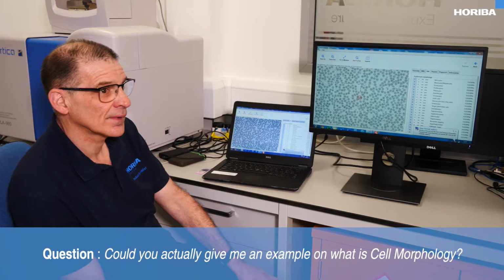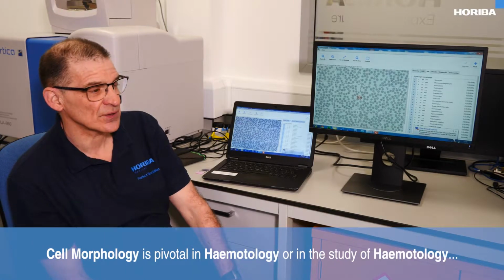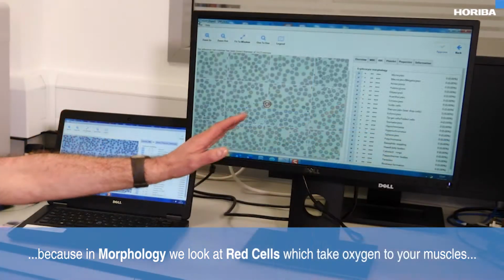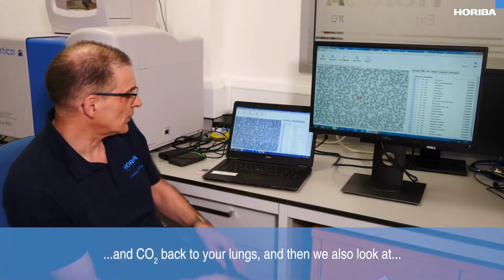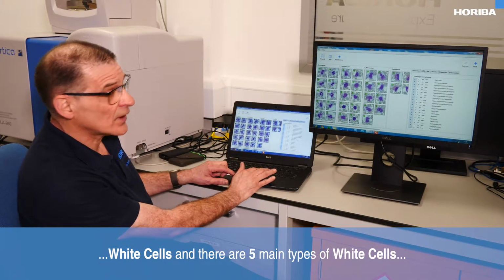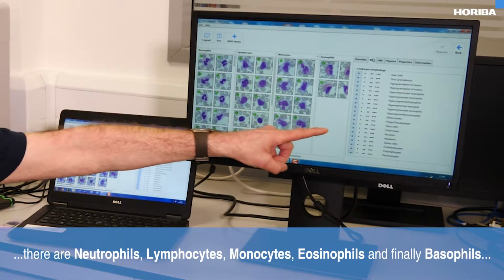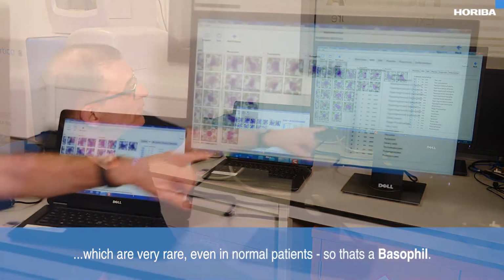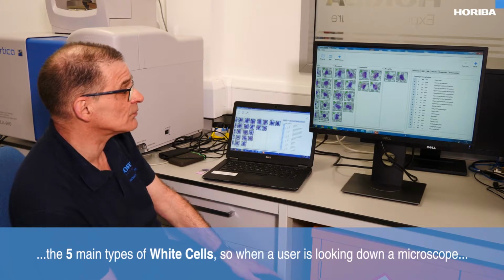Andrew, could you actually give me an example of what is cell morphology? Cell morphology is pivotal in haematology, or the study of haematology, because in morphology we look at red cells which take oxygen to your muscles and CO2 back to your lungs, and then we also look at white cells, and there are 5 main types of white cells. There are neutrophils, lymphocytes, monocytes, eosinophils, and finally basophils, which are very rare even in normal patients, so that's a basophil. And you can see from here there are substantial differences between the 5 main types of white cells.